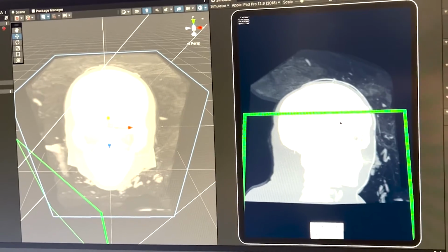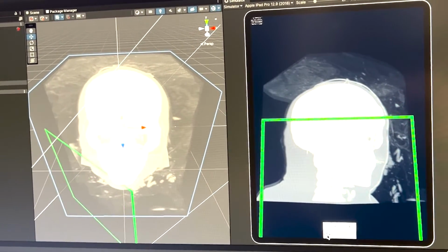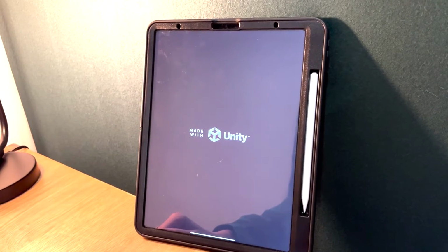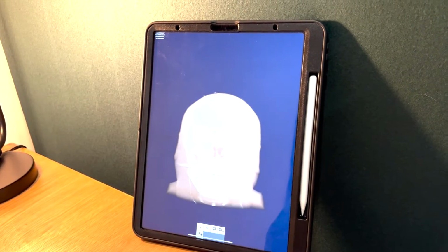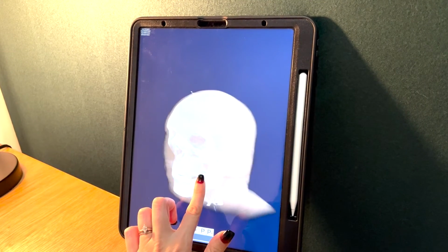In order to move past this, we pushed our data into DTP storage and pulled the data and built meshes on the device. We weren't streaming Unity assets, we pulled the data in and built the geometry on the device. For our proof of concept, we chose to fork a public GitHub repo that had found the same thing that we did regarding point clouds and processed it through the DTP with some simple camera controls and user interface and deployed it to iPad.